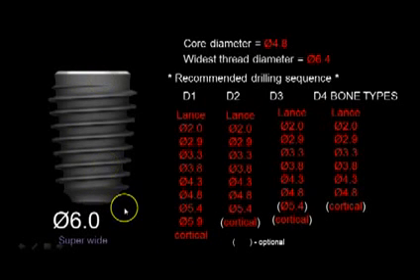You can do that if you so choose. But again, you really want to pay attention to that in D1 bone and not get these implants stuck. There is a ton of surface area with these implants, so for a molar scenario, you don't have to have a 6.0 implant or bigger. You can use, remember, a 5.0 or 5.5. 90% of what you're going to use is between 4.0 and 5.5 diameters.